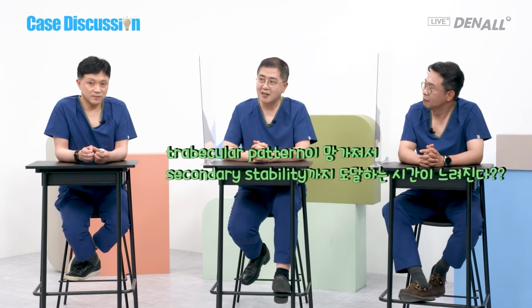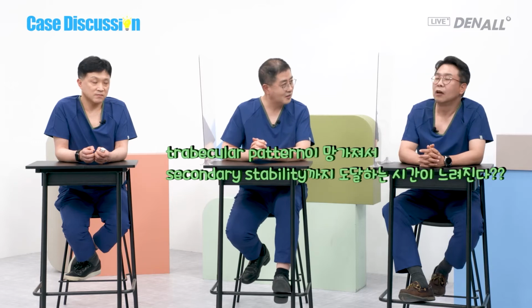I'm not sure if it facilitates the osteodensification. I need to use it more. I looked for the information. I think it's right. It can make the bone quality dense, but I heard that if you use the osteotome, trabecular pattern would be broken, slowing the secondary stability. So that's what I heard. What do you think? Between 2005 and 2008, papers came out on that subject.